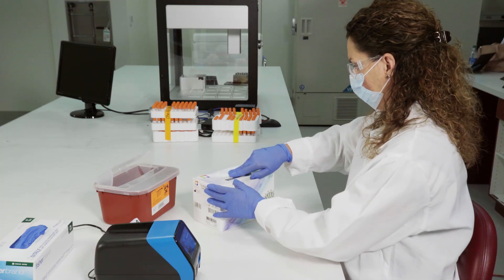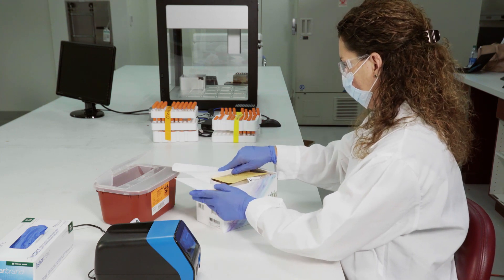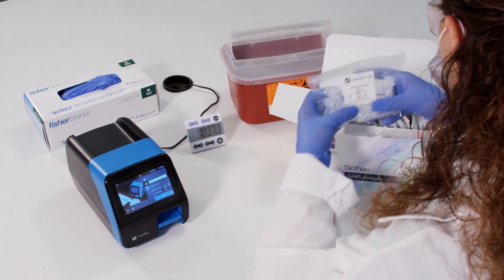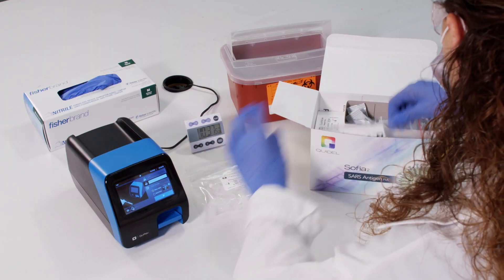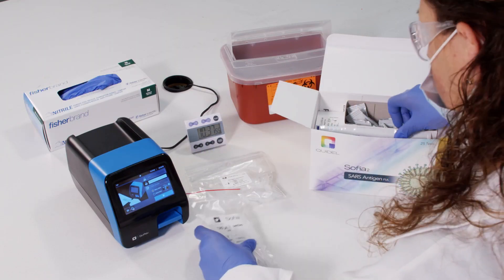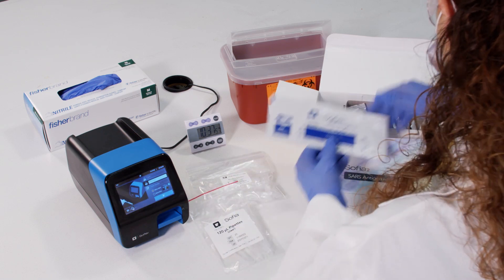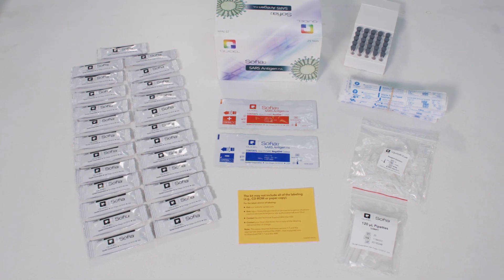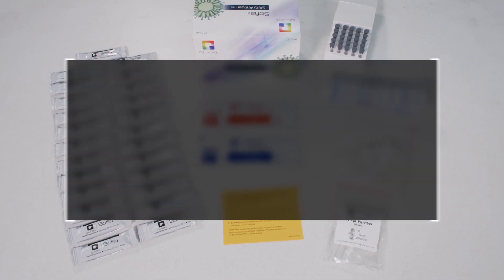Understanding kit components prior to performing patient testing is necessary to ensure a proper result is produced. Quidel provides all components necessary to run testing with SOFIA2 assays, and we recommend that you use the swabs contained in each kit. The materials contained in the SOFIA2 SARS Antigen FIA kit include the following.